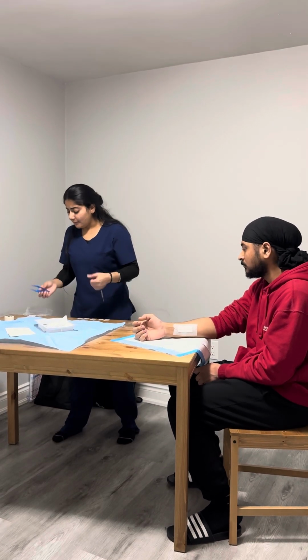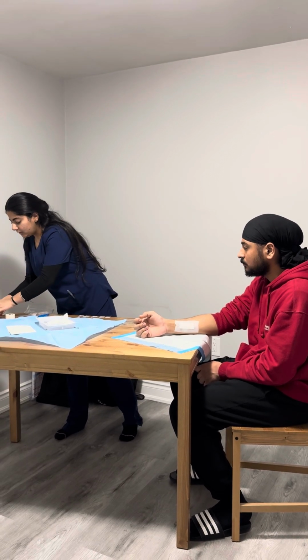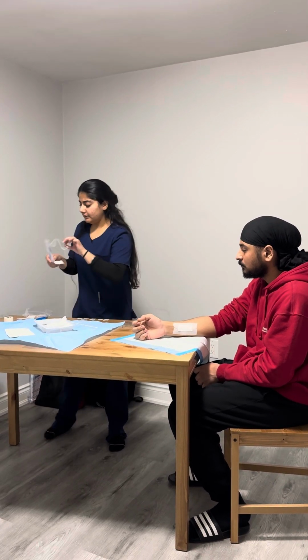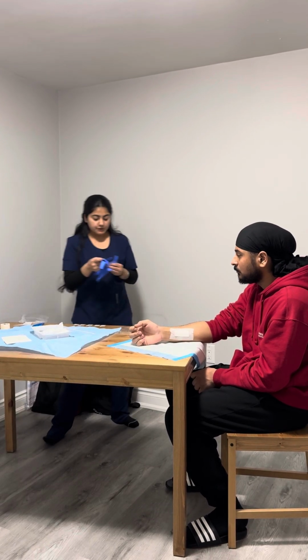So I'm going to put this forceps here, making sure the 1-inch border here. So I'm going to put the Q-tip just to mirror the length of the wound afterwards. Okay, so after my hand hygiene, I'm going to put the clean gloves on to remove the existing dressing of the patient.